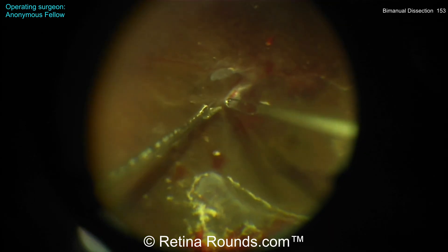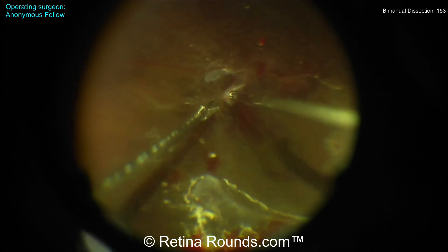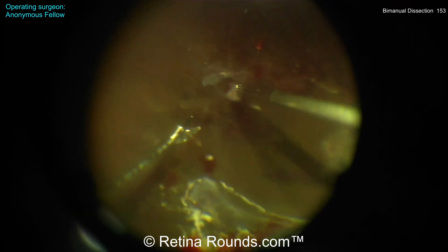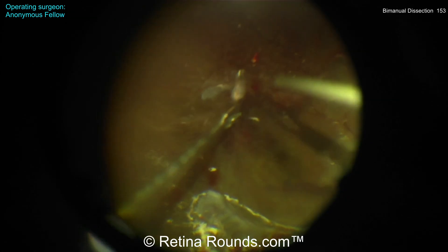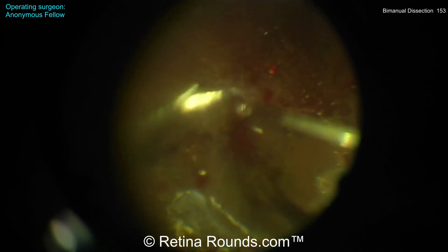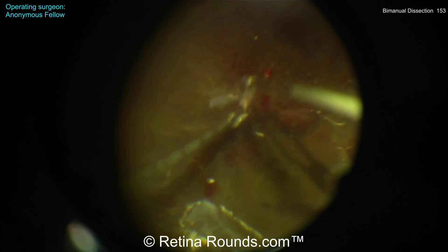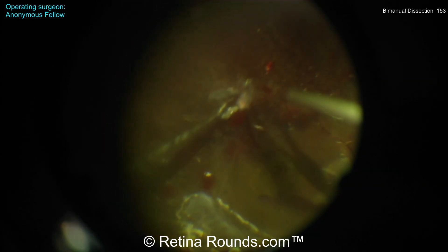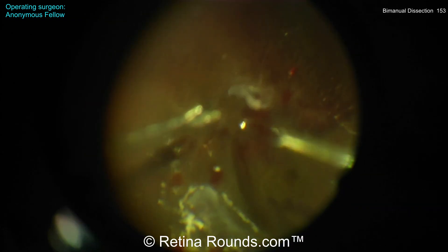Now the surgeon has switched over to a bimanual technique, and there are a couple of things to notice. The forceps held in the right hand are not adequately being pulled back to reveal the correct surgical plane. Now that's much better — you can see that the membrane is being reflected backwards. The idea is that you want that membrane pulled back so that you can see the interface between the gel and the underlying retina.